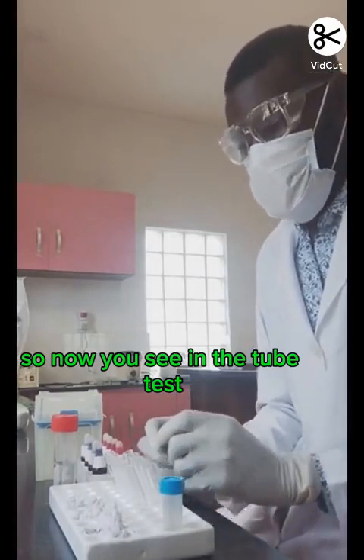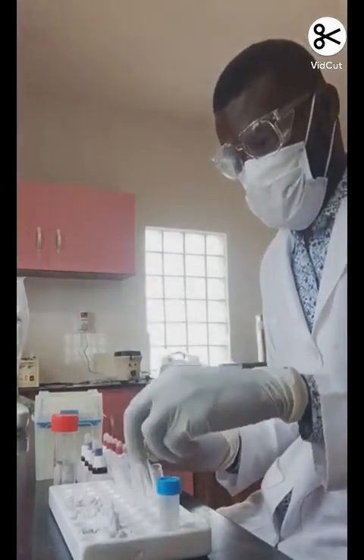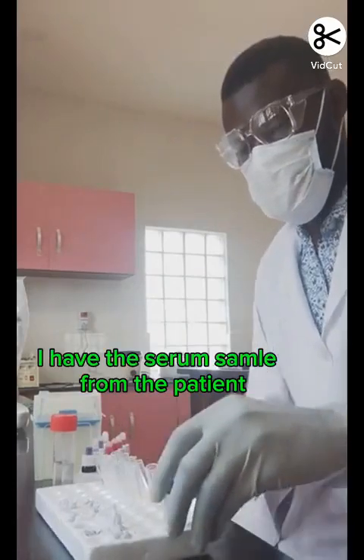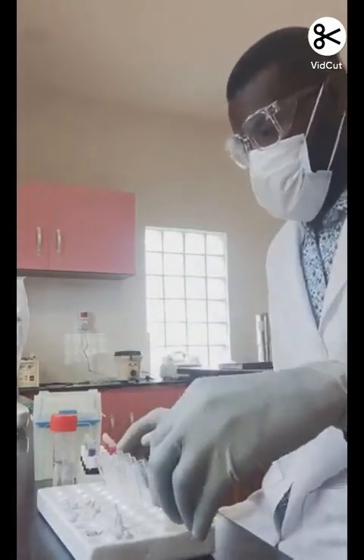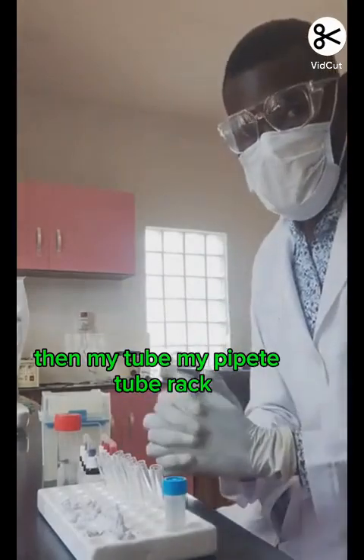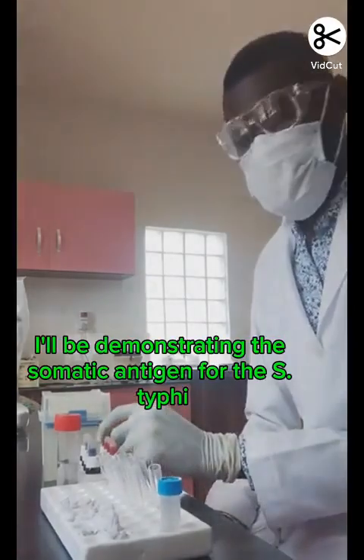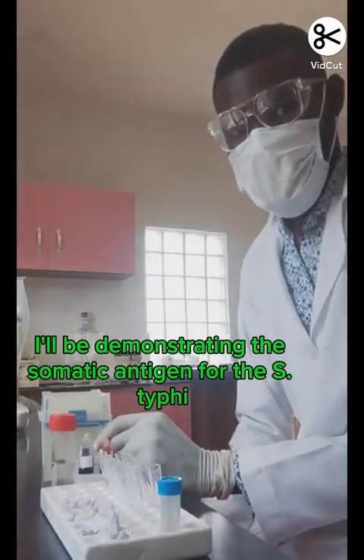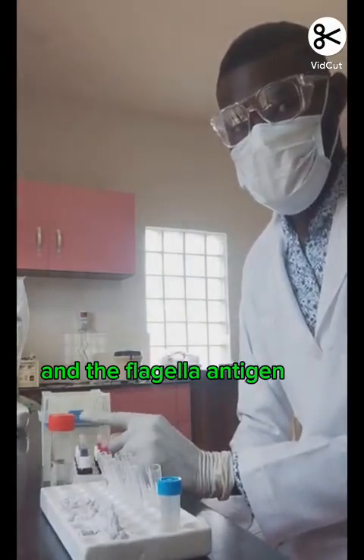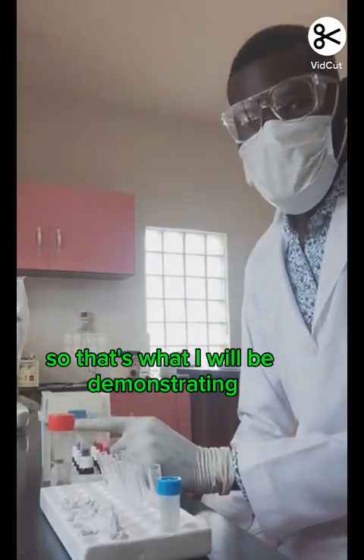Now you see in the tube test, I have my tubes arranged. I have the febrile antigen, the serum sample from the patient, my normal saline, and my pipette and tube rack. In running the tube test, today I'll be demonstrating the somatic antigen, S typhi O, and the flagellar antigen, S typhi H. So that is what I will be demonstrating.